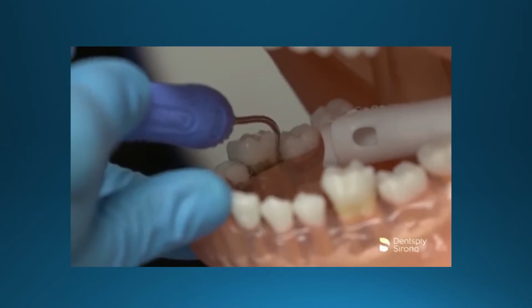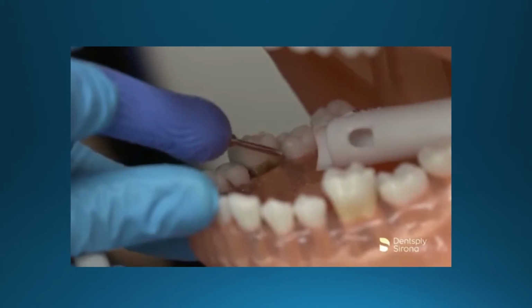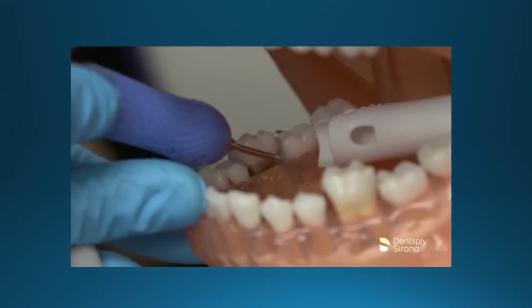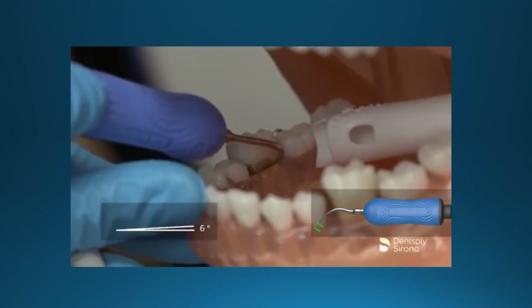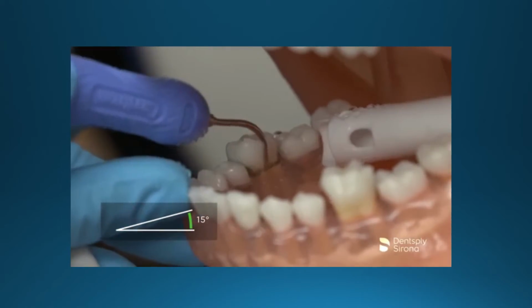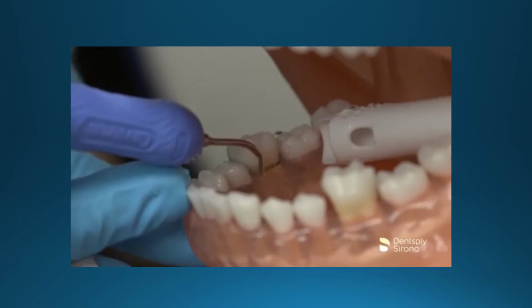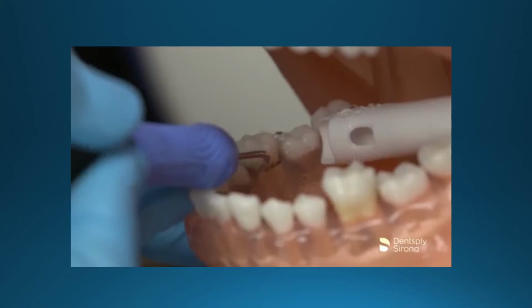The clinician begins instrumentation by adapting the lateral surface of the Cavitron FSI 100 on the clinical crown and uses the back and/or face of the insert tip as needed. The clinician demonstrates a transverse oblique approach, maintains 2 to 3 millimeters of adaptation, and 0 to 15 degrees angulation. The clinician continues scaling and demonstrates strokes in the horizontal, transverse, and vertical orientation to fracture and remove deposits. Utilizing an overlapping methodical stroke pattern is essential to achieve thorough removal of biofilm and calculus.